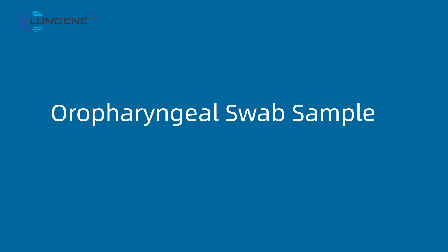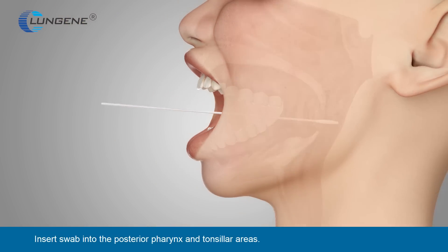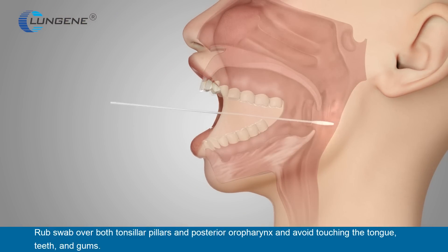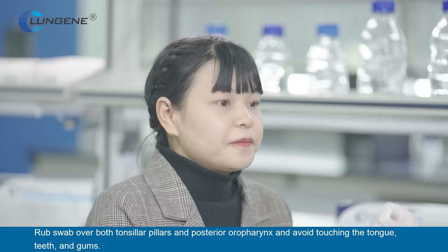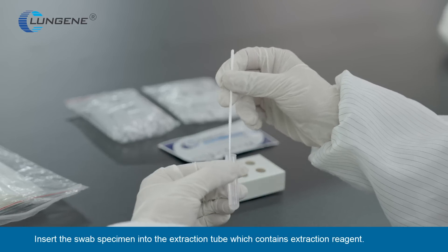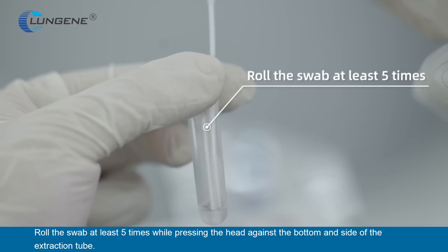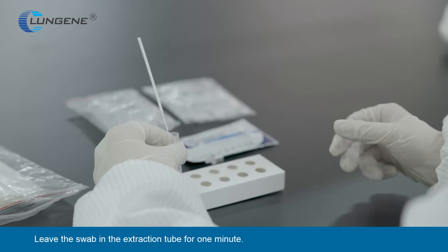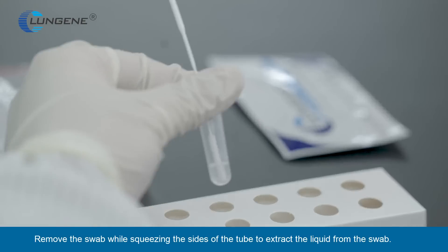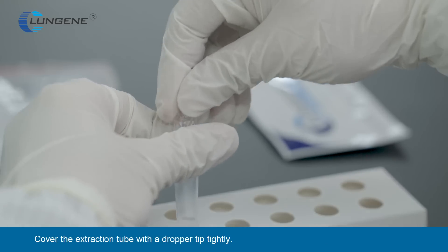Oropharyngeal Swab Sample: Insert swab into the posterior pharynx and tonsillar areas. Rub swab over both tonsillar pillars and posterior oropharynx, and avoid touching the tongue, teeth, and gums. Insert the swab specimen into the extraction tube which contains extraction reagent. Roll the swab at least five times while pressing the head against the bottom and side of the extraction tube. Leave the swab in the extraction tube for one minute. Remove the swab while squeezing the sides of the tube to extract the liquid from the swab.